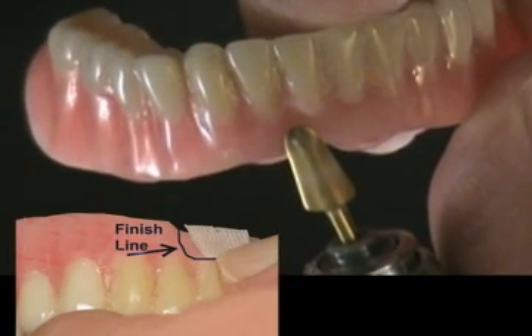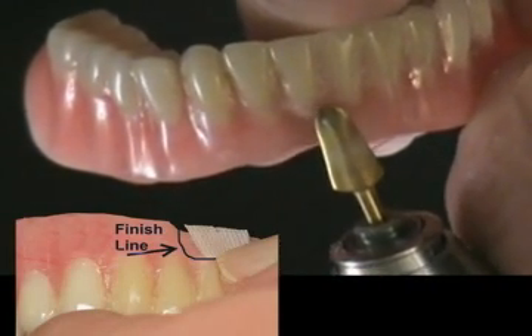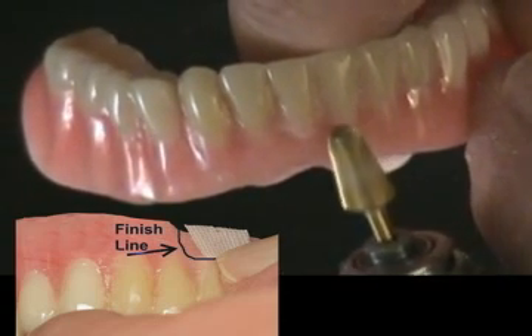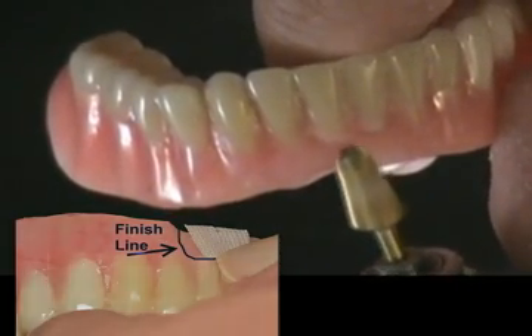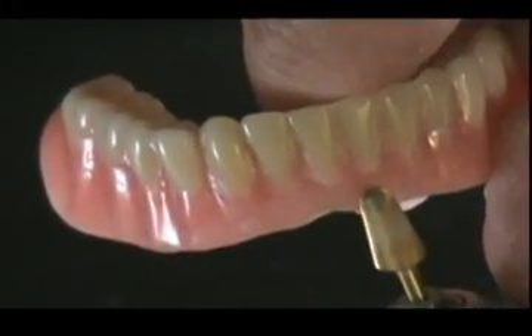Permamesh is recommended for the repair and reinforcement of the facial surface of the denture base. Use a silicone polisher or acrylic burr to reduce a small amount of acrylic resin from the area to be repaired — three tenths of a millimeter is adequate. A small ledge is recommended as a finish line when using Permamesh.